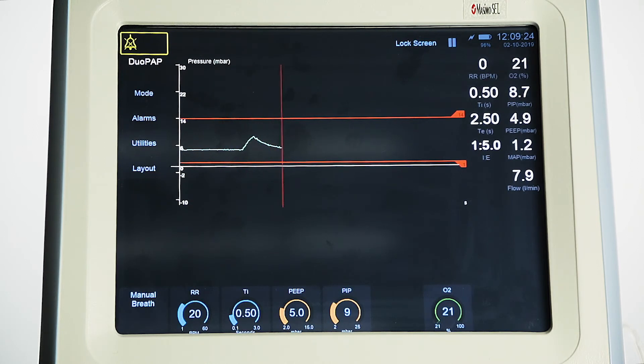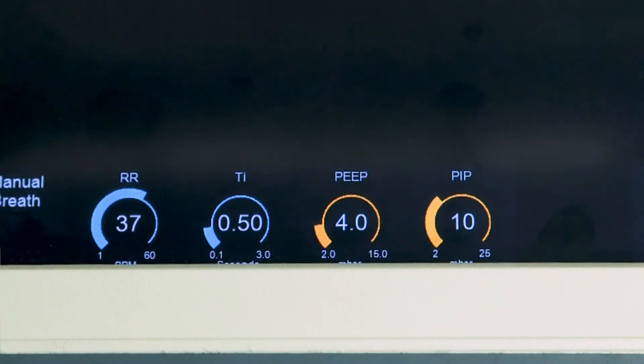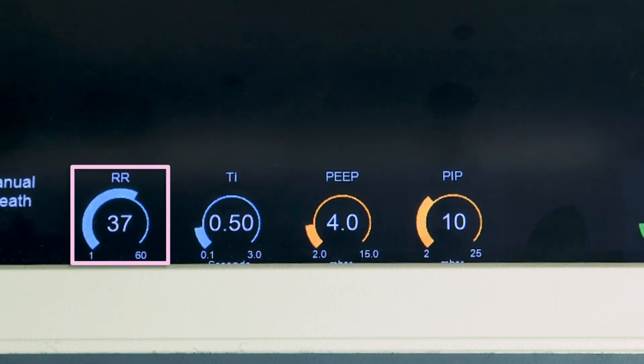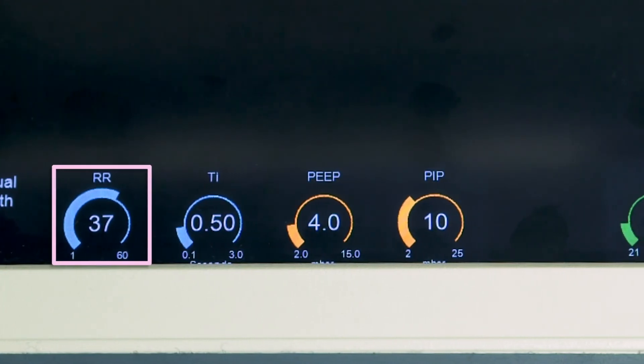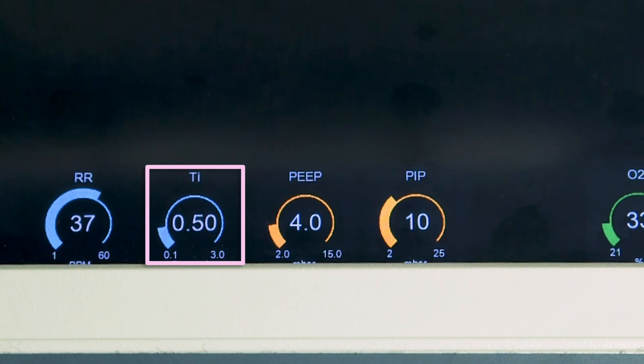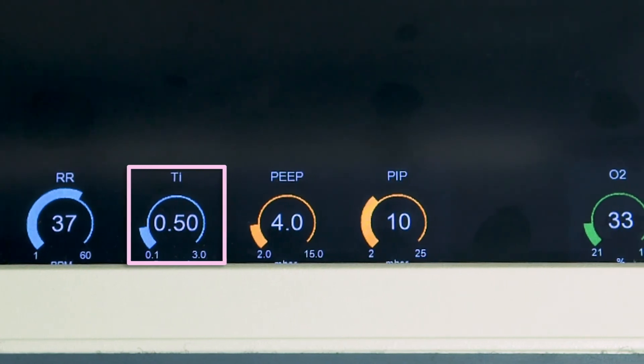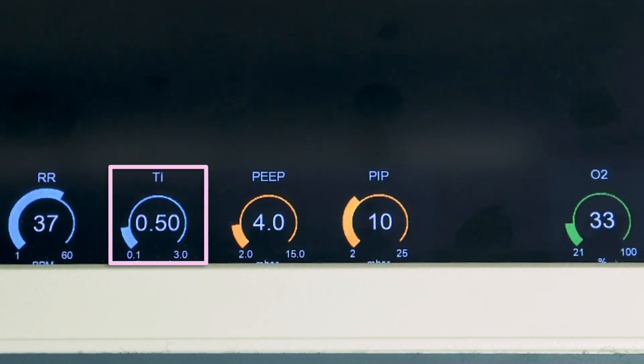It provides at a fixed rate ventilation at a user-defined positive pressure. On the screen, the user will set RR, which is the ventilation rate, and TI, which is for fixed rate ventilation and manual breaths.